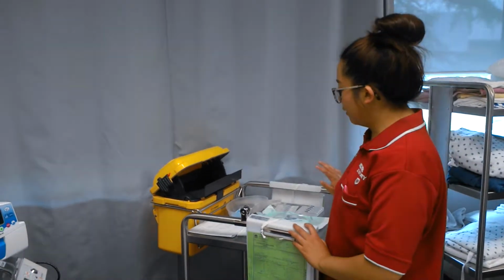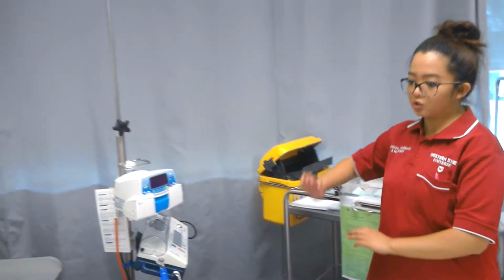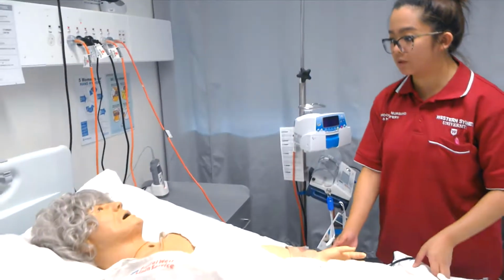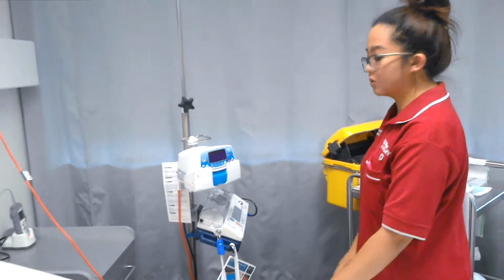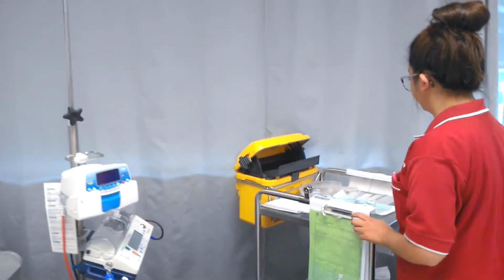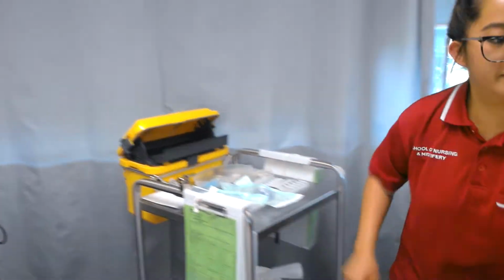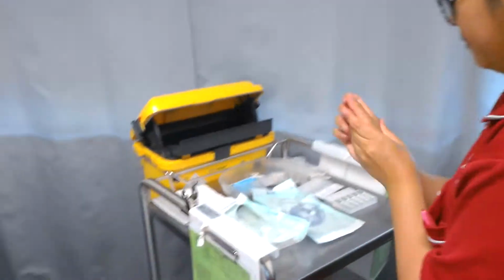Hi Miriam, I've gathered all the equipment, but before I can prepare and give you the medication, I just need to ensure that I do your vital signs. So I'll be doing that so I can get a base reading of your vital signs. And I'll come back also in a few minutes, so I'll just prepare the medication now. Okay, Miriam, I have to check your vital signs also.